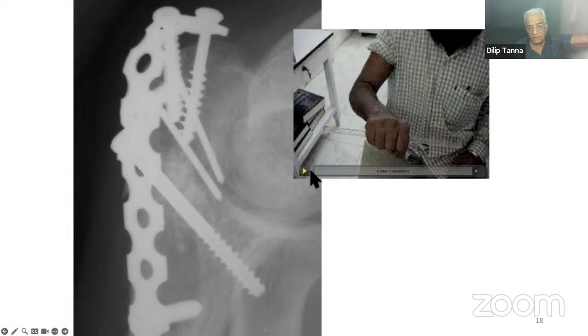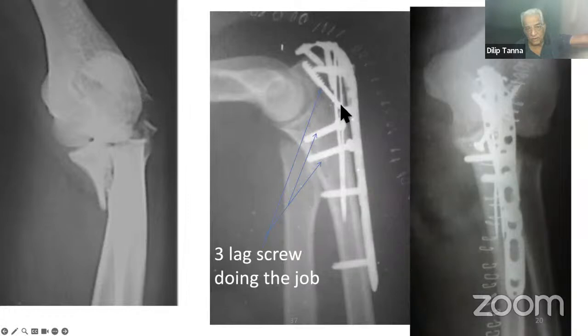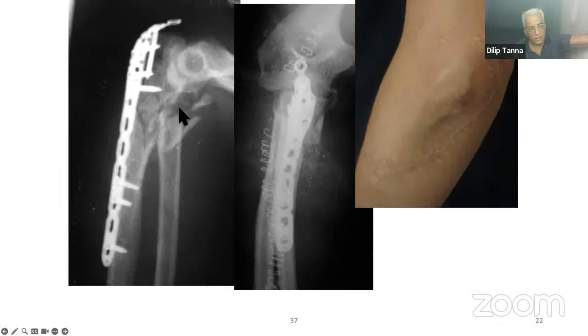Now here was again a comminuted olecranon. This is the one which is giving you the fixation, and then these two lag screws are doing the job. These are supplementary wires, and then three lag screws doing the job, 1, 2, and 3. This is a badly comminuted fracture, you can see. And that's the reason why ultimately things become all right. This is still more comminuted. And still more comminuted, reconstruct the fossa.